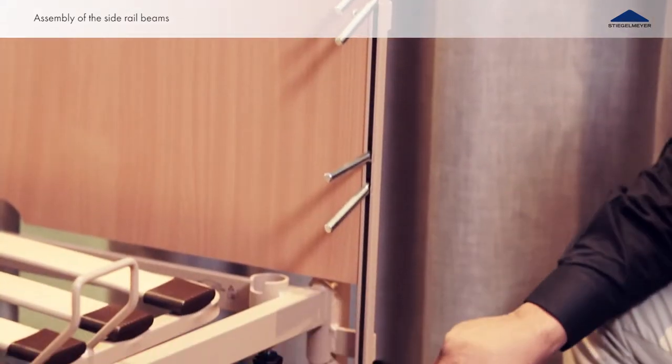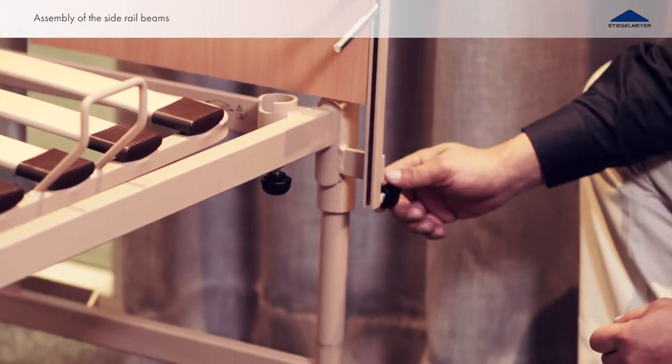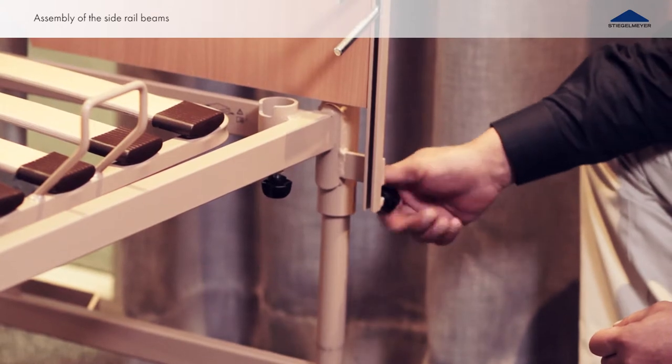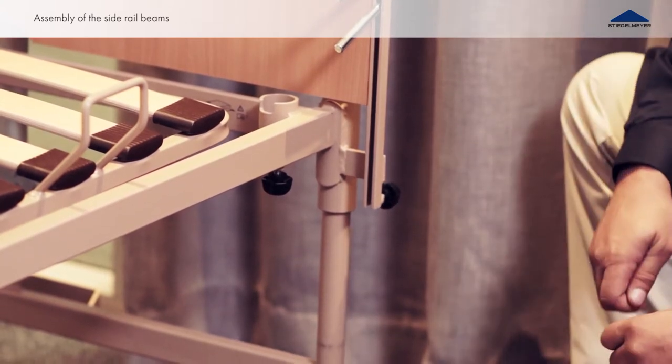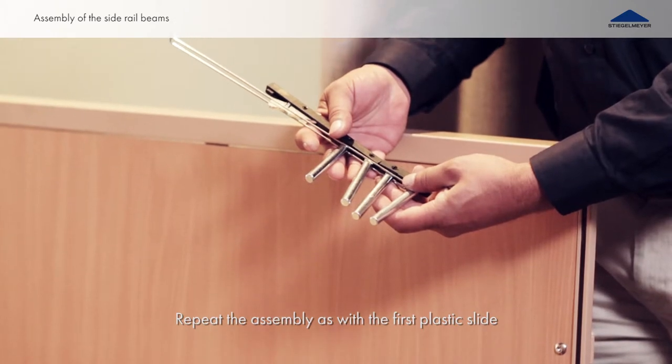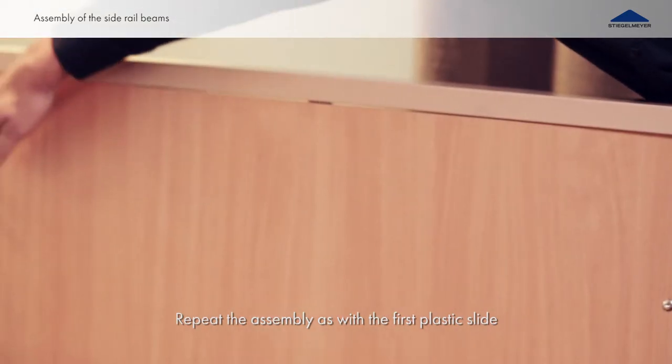In order to prevent the plastic slide from falling out of the guide track, reinsert and tighten the knurled screw. Insert another plastic slide into the opposite side of the same end board.